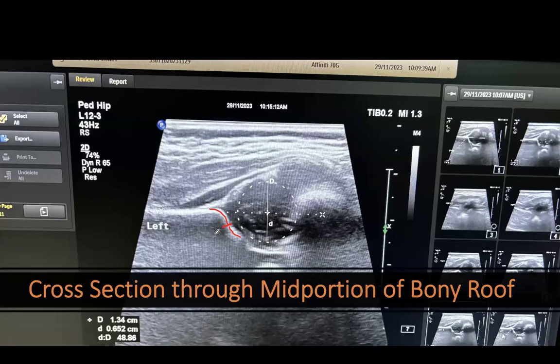Okay. And the scan has to be in the standard plane for us to draw this? No. So this is your first check. You're still in checklist one. In checklist one, you're going to see the chondro-osseous border, femoral head.